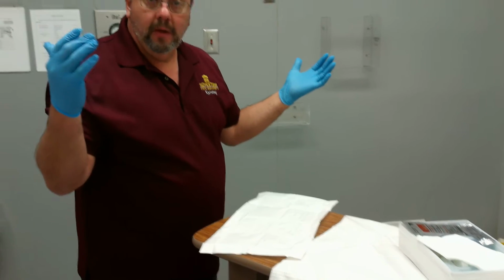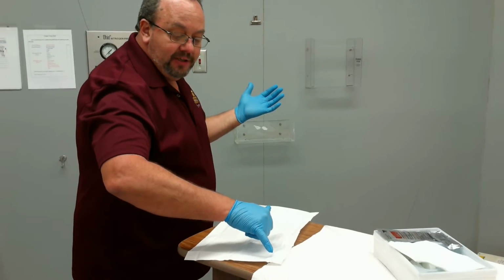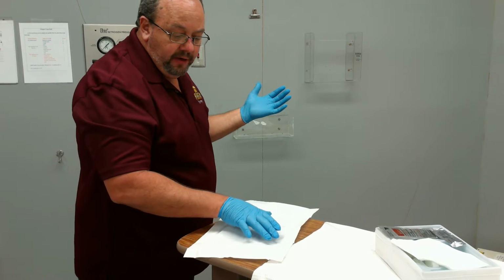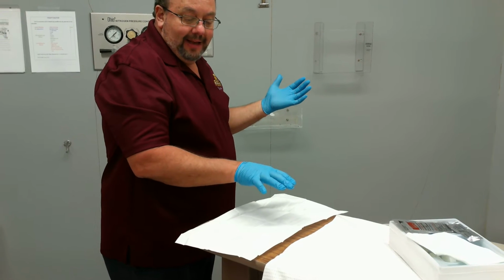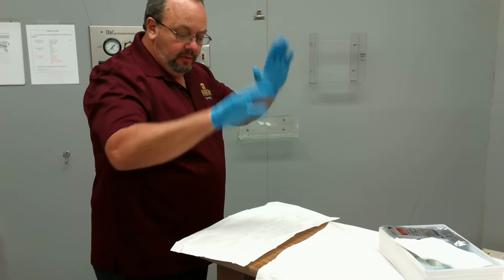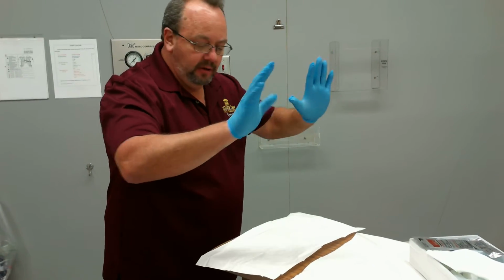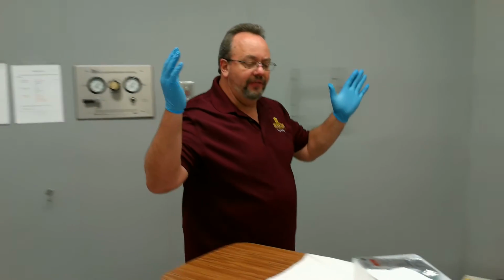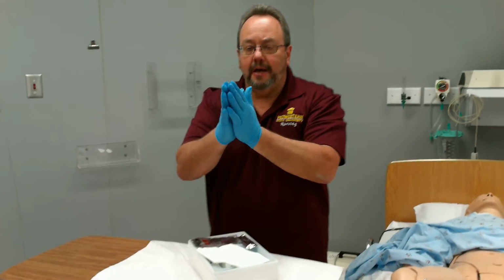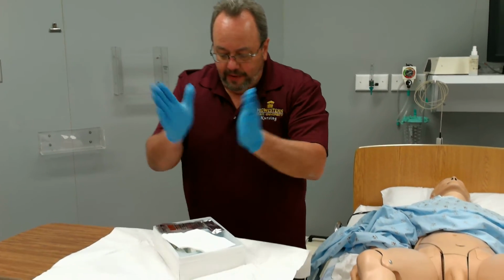Careful when you take this off, making sure that that does not cross into your sterile field here, because I'm practically into my sterile field there, so I can get that out of there. I can touch sterile to sterile, but I can't touch that 1 inch border now with my sterile gloves on. I'm going to get rid of this so that it does not get into my sterile field. I'm going to keep my sterile hands up at all times, praying position, and out in front of me.